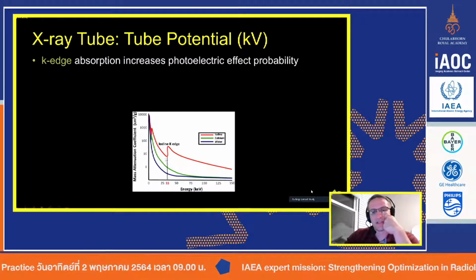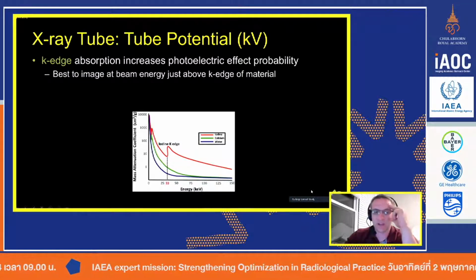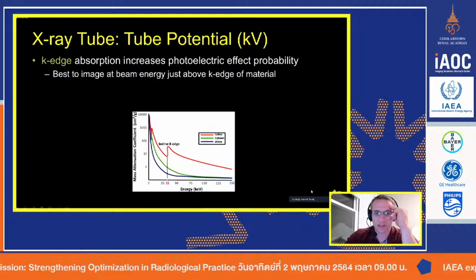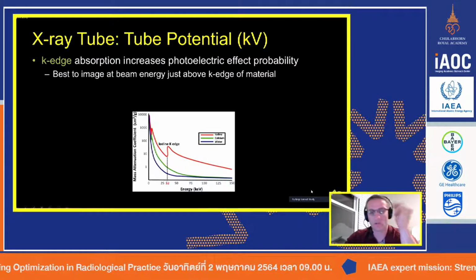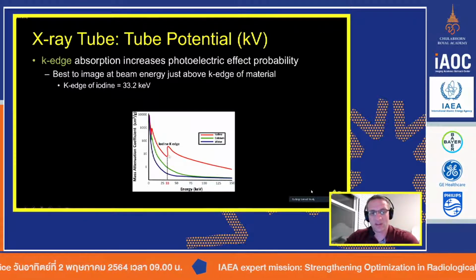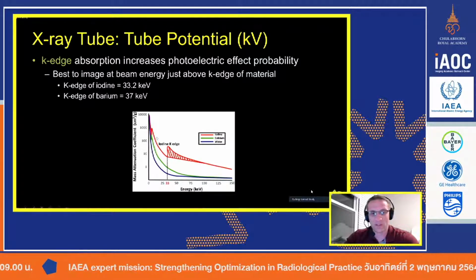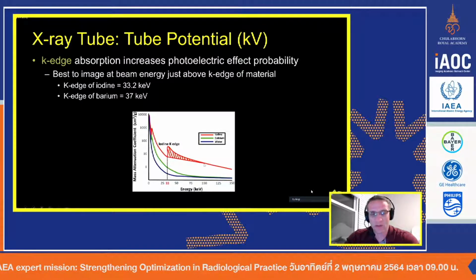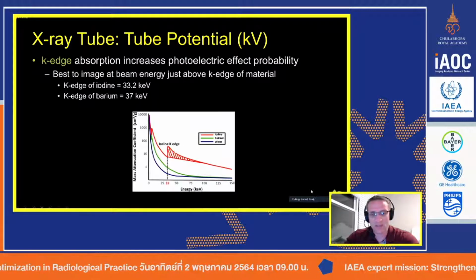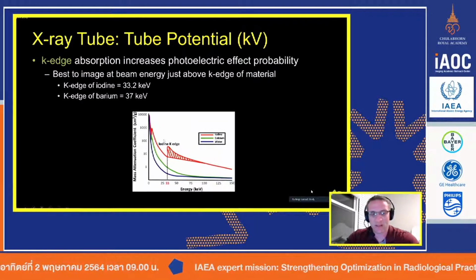And one of the benefits to this iodine and the barium is there's what's called a K-edge. This value where the attenuation properties go from very low to very high almost instantaneously, over a very, very short amount of change in energy. And so the closer we image to this K-edge, you get this nice enhancement. If this curve was continuous, it would go like this. It would just keep going. But because when we image anywhere between this KV and this KV, we get an enhanced amount of attenuation when we look at an object with that K-edge, in this case iodine.